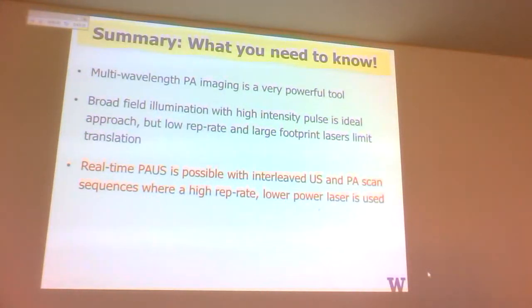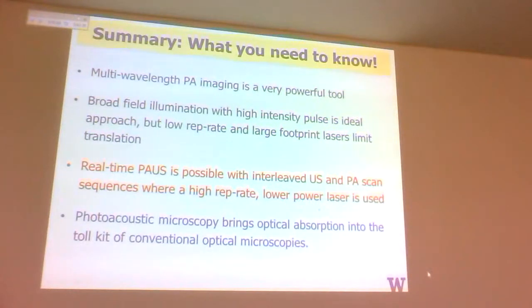And I alluded to one before, and I'll show you some examples, I think, in the next section. And the last piece is photoacoustic microscopy, which is a very interesting area. It's still not clear where it's going to come into play, but its complement can be added. The way I like to think of it, you can add to the toolkit of conventional optical microscopies the ability to do things wavelength-sensitively and do molecular identification without labels.